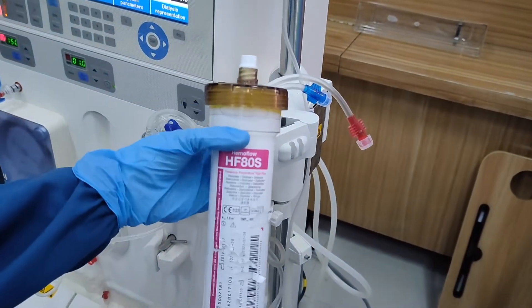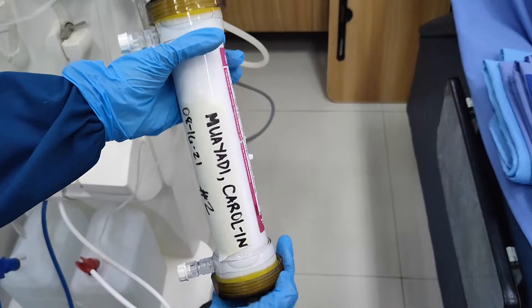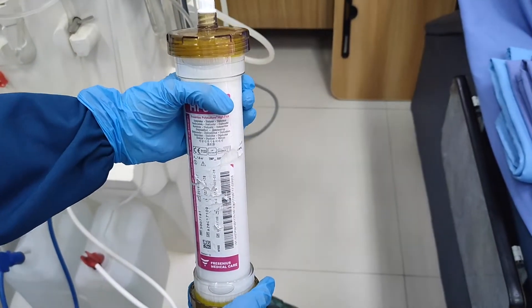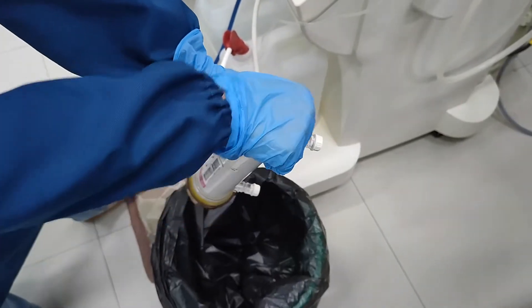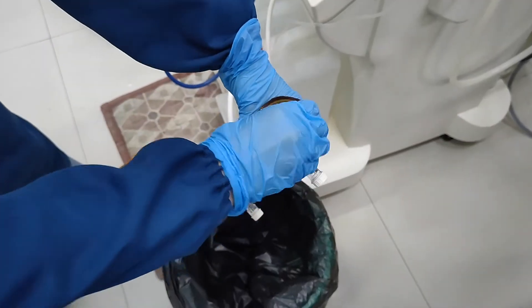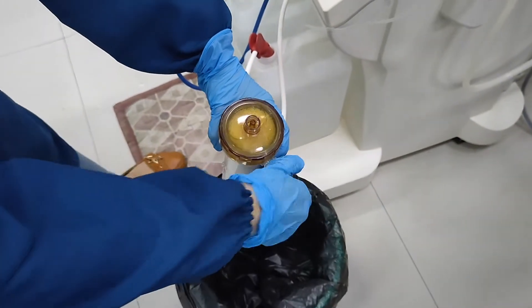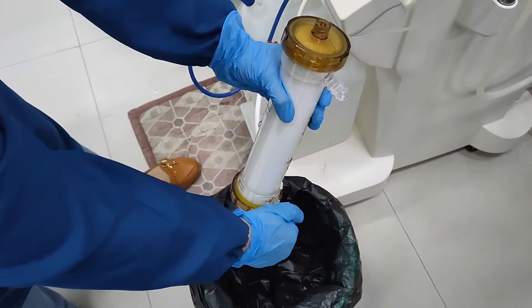The patient is using the dialyzer. Check for the full name of the patient, the date it was last processed, and the number of reuses. Remove all caps or covers and make sure you have prepared a bucket right next to the machine.